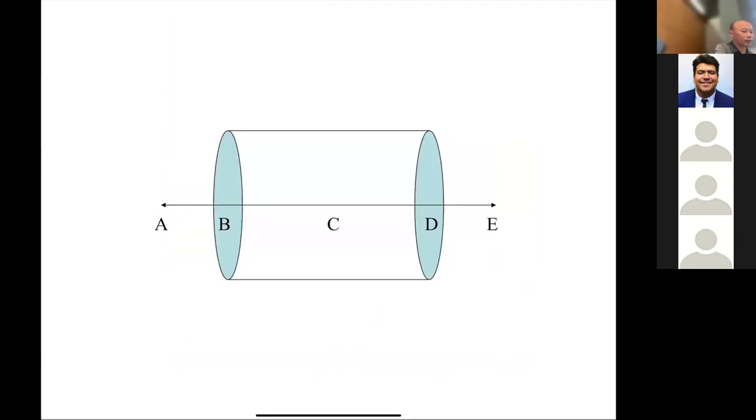Okay, so let's do our first in-class exercise. We're going to do a little thought experiment here. Imagine you're doing MRI research for your master's or PhD, and you walk into the magnet room, and you forgot about this lecture. You're carrying an iron wrench, and you're walking towards the magnet. At point A, the wrench gets ripped out of your hands. None of you are strong enough to hold a wrench close to a magnet.